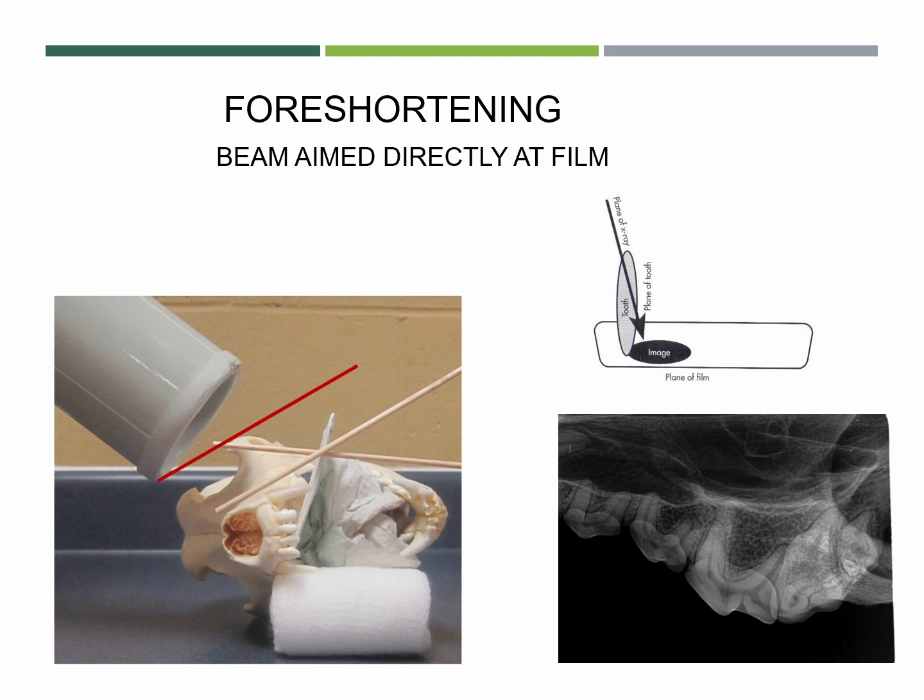You're aiming too much at the film. See how we're aiming through the top of the tooth, too much at the film? And look at those stubby little teeth, right? They're super stubby. That's because the angle's wrong. Right?